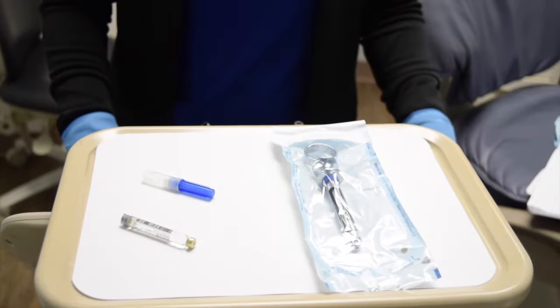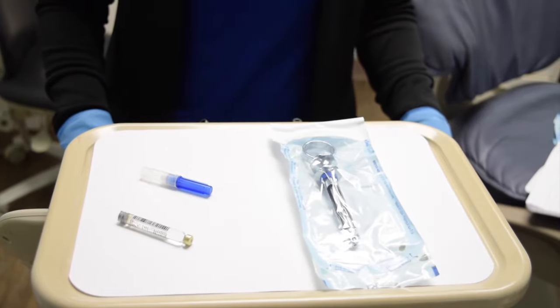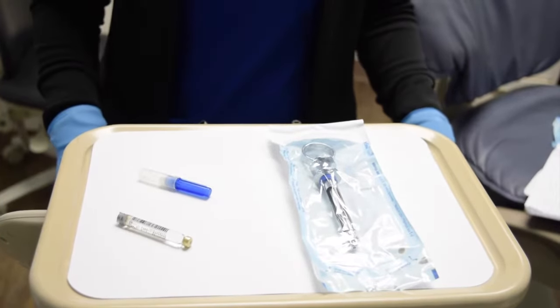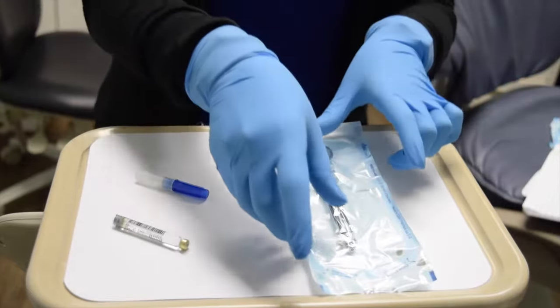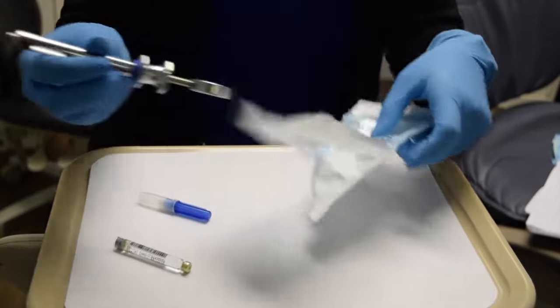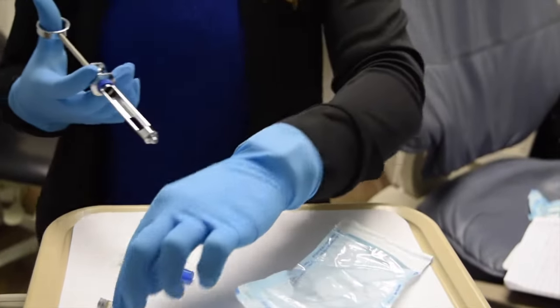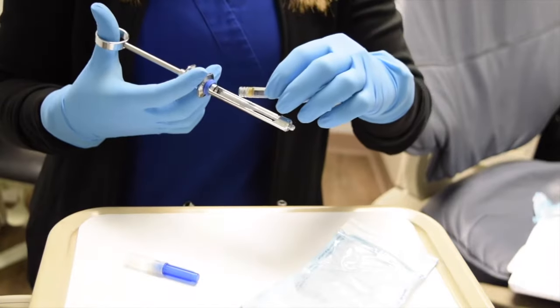When assembling a syringe, first you'll start by determining which type of anesthetic and which size needle your doctor prefers. You'll remove the syringe from the sterilization pack. You will pull back on the thumb ring and insert the carpule.